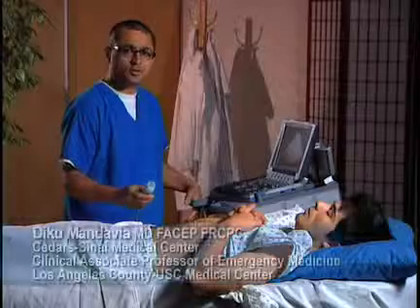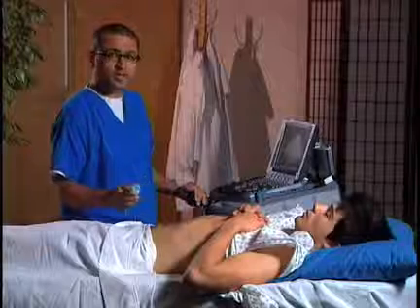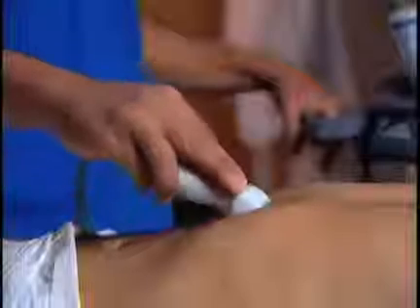The next view I'm going to take you through in the FAST exam is the subcostal view of the heart in a 4-chamber plane. For this, we're going to put our transducer, the phased array, to the subxiphoid area, aiming toward the patient's left shoulder. Here's the probe marker, which I'm going to angle toward the patient's right.